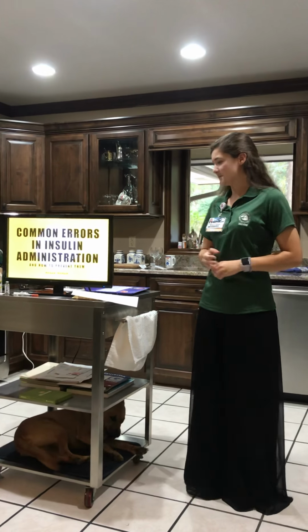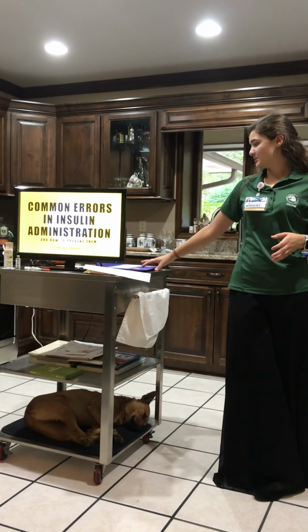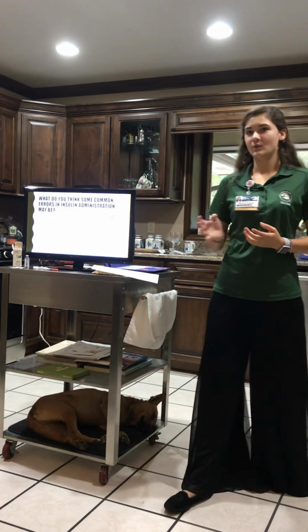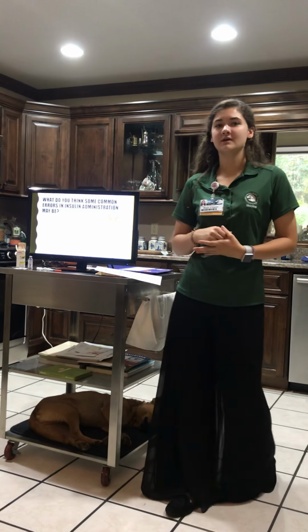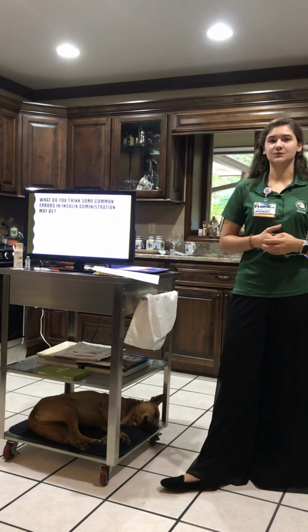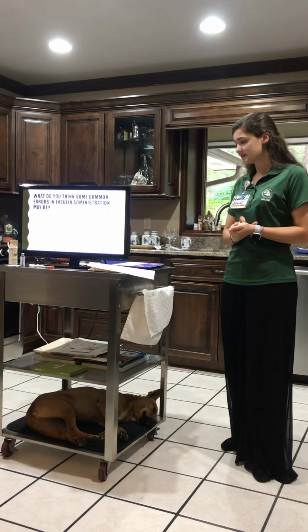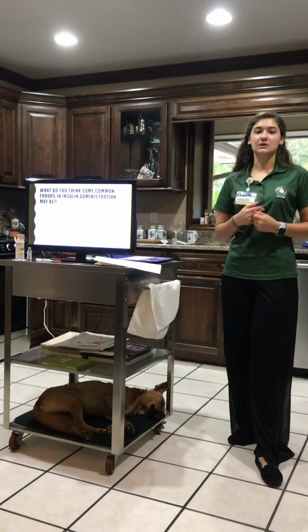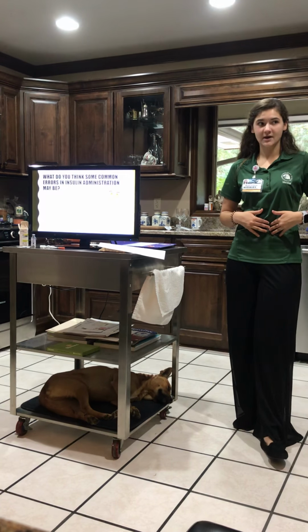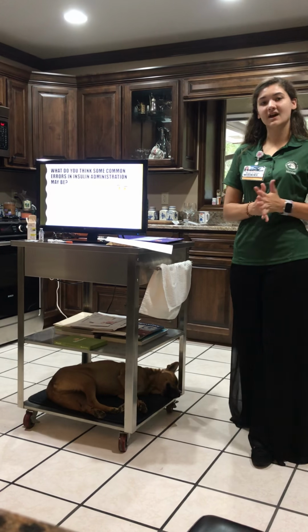Hi. Alright, so what do we think some common insulin errors could be? Well, sometimes we don't store our insulin properly. Sometimes we don't draw up the correct amounts of insulin before we inject. Sometimes we don't clean our sites on our bodies or our insulin vials correctly, which can lead to infections.